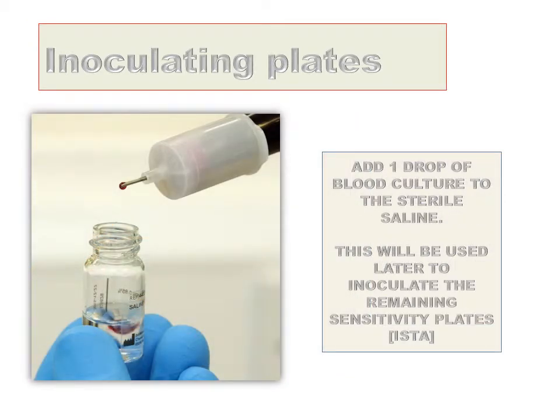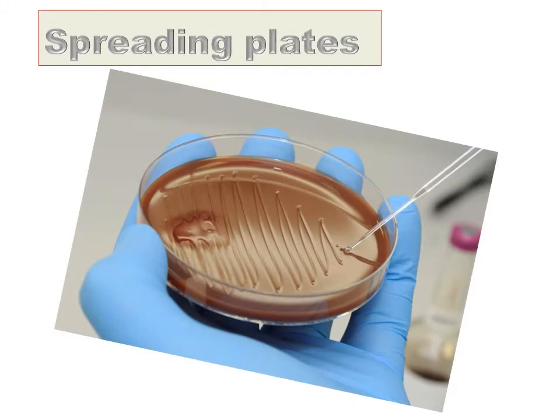Lastly, add one drop of the blood culture to the sterile bijou containing saline. This will be used later to inoculate the remaining two sensitivity plates. Use a sterile plastic loop to spread the blood agar, chocolate and chromogenic media plates.